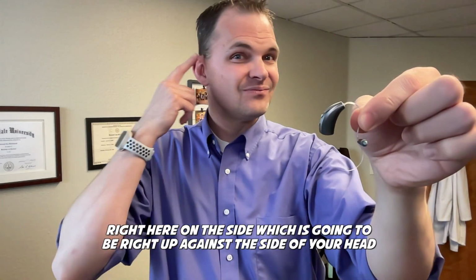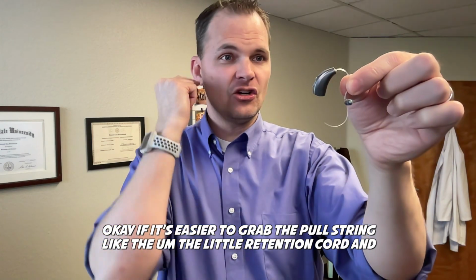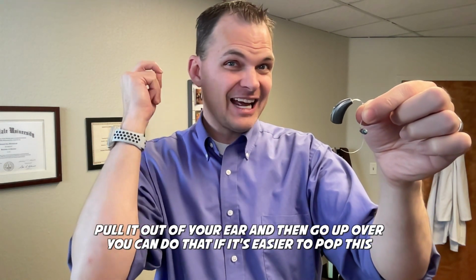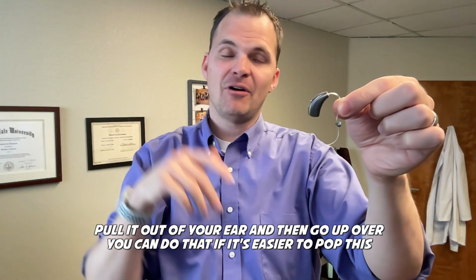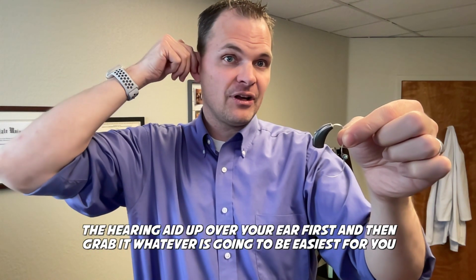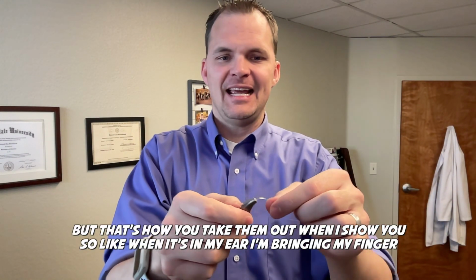It's just right here on the side, which is going to be right up against the side of your head. If it's easier to grab the pull string, the little retention cord, and pull it out of your ear, and then go up over, you can do that. If it's easier to pop the hearing aid up over your ear first and then grab it, whatever is going to be easiest for you. But that's how you take them out.